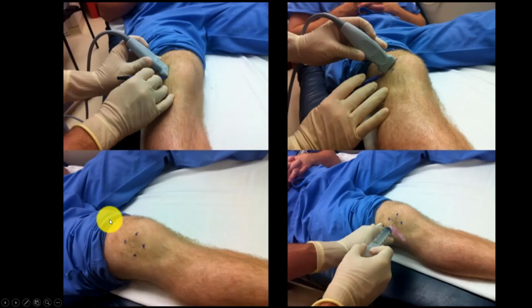The first is to actually find the effusion in both the long and the short axis view. Get the effusion in the middle of your ultrasound screen, and then mark with a marking pen each side of the ultrasound probe and create 4 little dots on the patient's joint like this. Connect them, and the point at which they all meet is the spot at which you should inject.